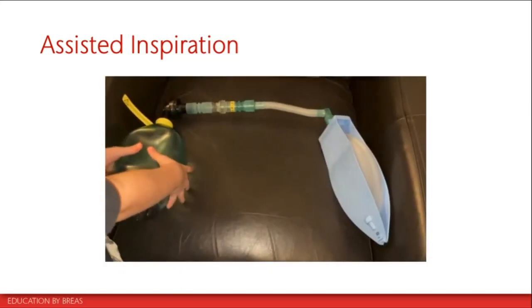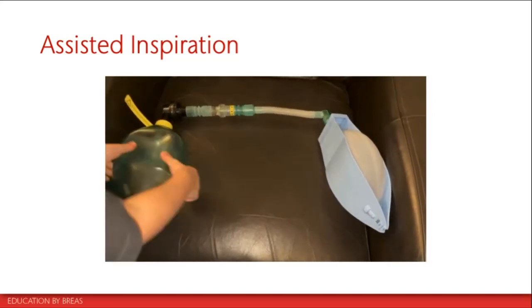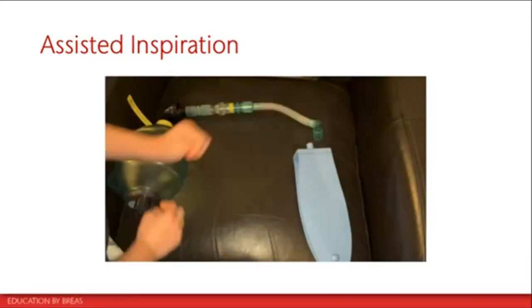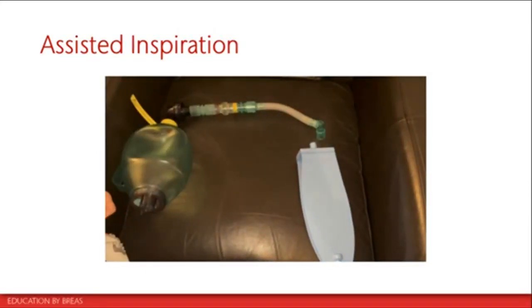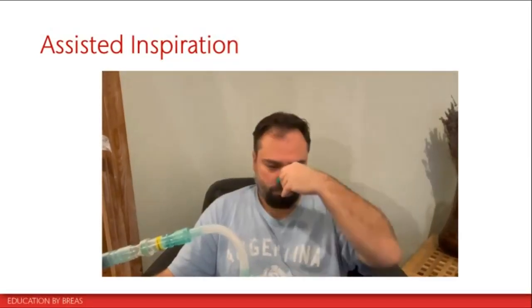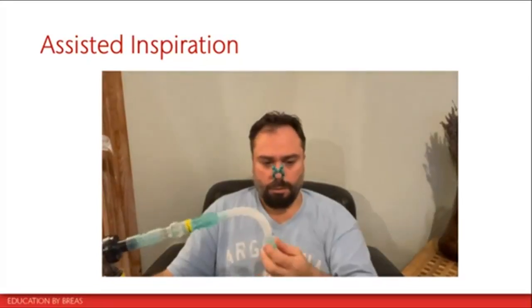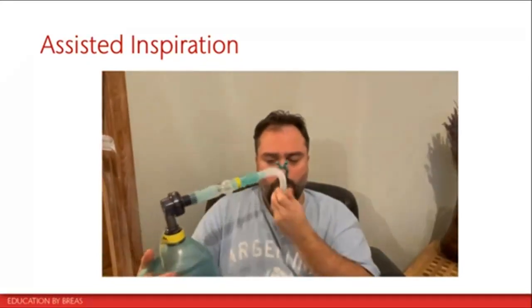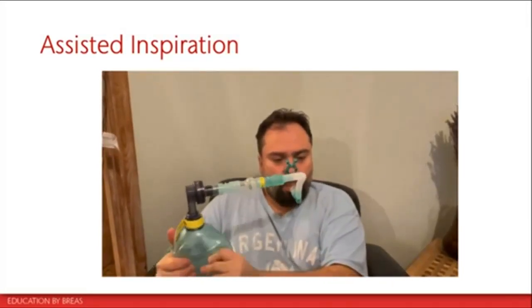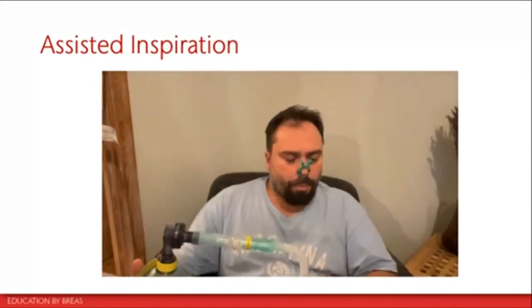So this is a lung volume recruitment bag. It only delivers a breath in because it has a one-way valve, and you can see that the artificial lung inflates on every single breath. This is with the patient. Pop your nose clips on for me. Take as deep a breath in as you can. Pop it in your mouth and squeeze some extra air in. One, squeeze again, squeeze again, squeeze again. Take it out and breathe out now you're full.